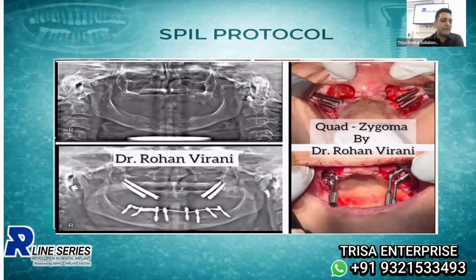Now look at this, even crazier. Conventional two-piece zygomatic implants for a resorbed jaw in the maxilla. It's a quad zygoma case. Even the anterior maxilla is not available for BCS implants. And of course, when you want to do quad zygomas, you want to have retrievability just in case there are any problems. You want that peace of mind with retrievability.